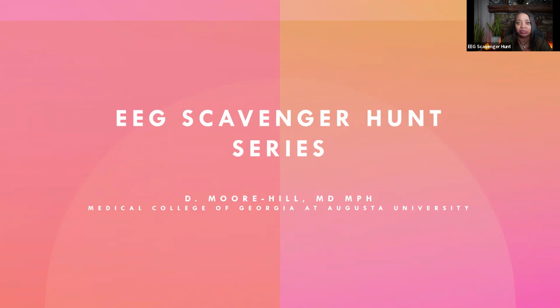These will be posted periodically. It will be a series. You will get one page of an EEG, and I will tell you how many findings there are on each page. This first video serves as an introduction to the series. We want to start the conversation about EEG. I know that EEG is very intimidating, and as a new reader, one must just jump in.